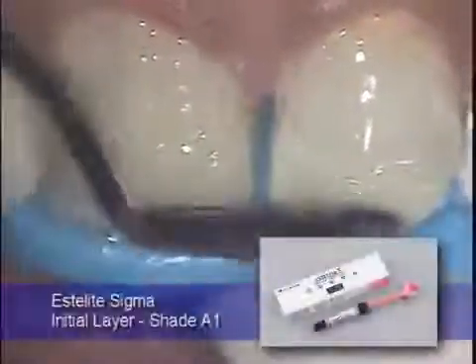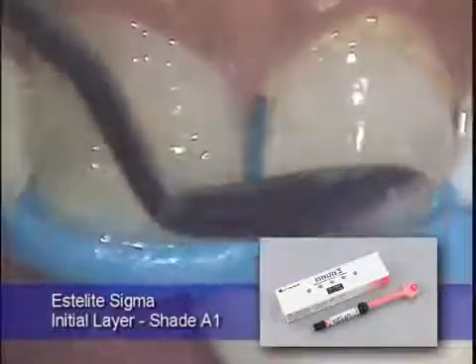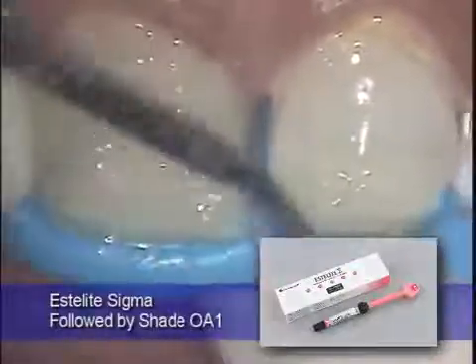Here, the upper left central incisor is now going to be corrected using Estelite Sigma composite. The initial layer, the A1, allows for incisal translucency. This will be followed by the use of the OA1 at the midline in order to block out any gray discoloration coming from the inside of the mouth.